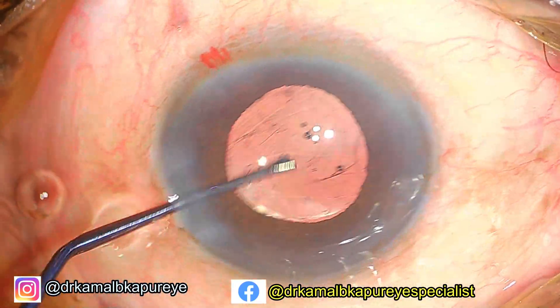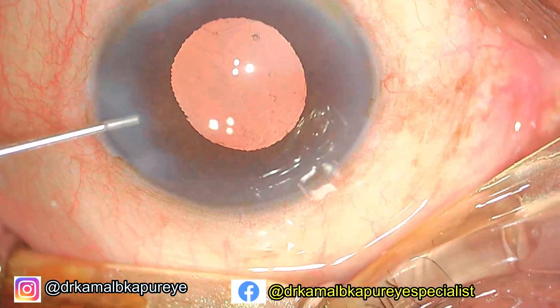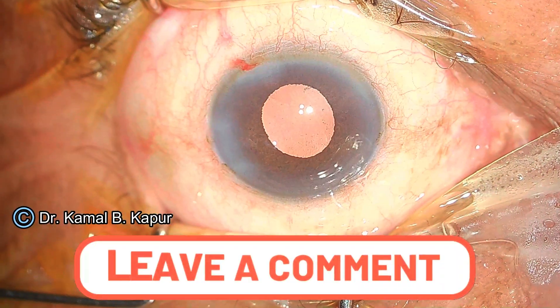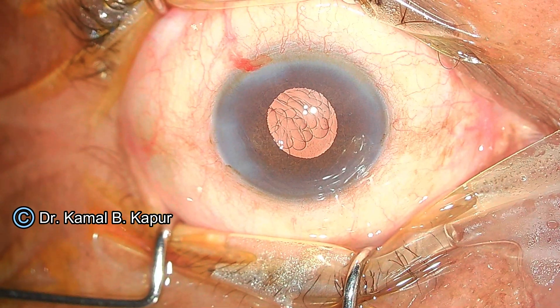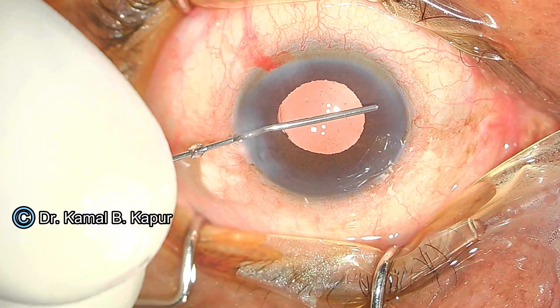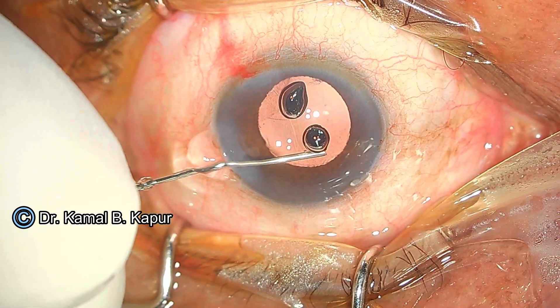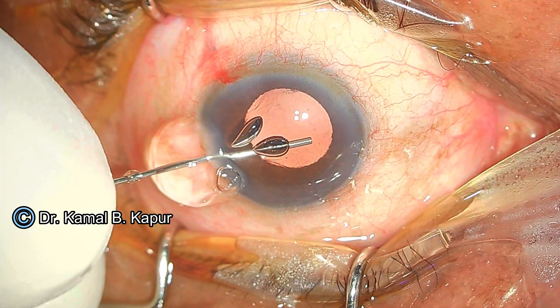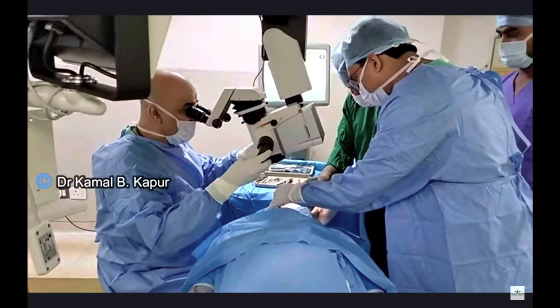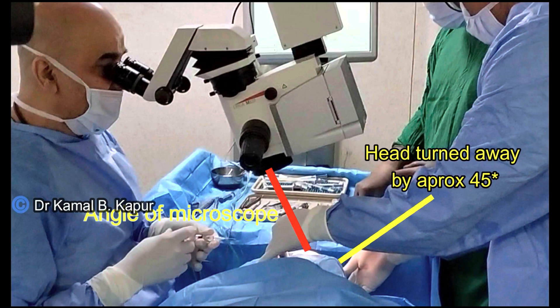After implanting the IOL and removing viscoelastic from behind it, instill pilocarpine and notice the pupil shutting down. Then instill cohesive viscoelastic into the angle area exactly opposite to the wound. Make sure there are no air bubbles in the anterior chamber, as they will interfere with visibility of the angle.